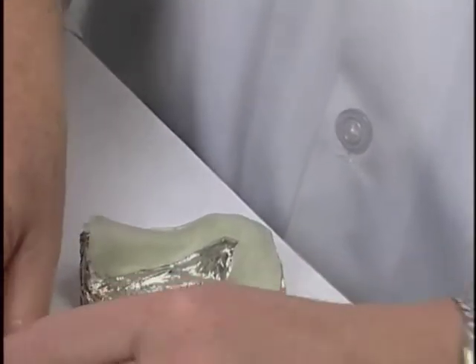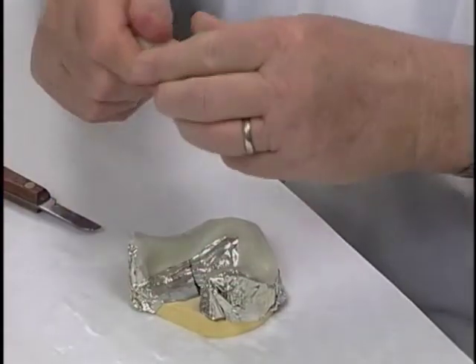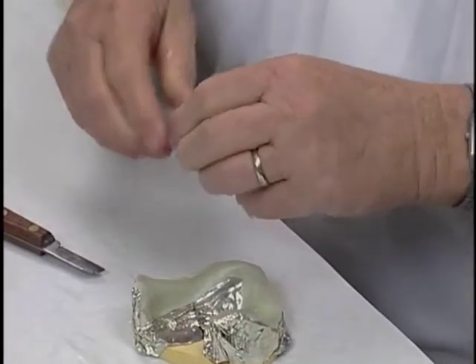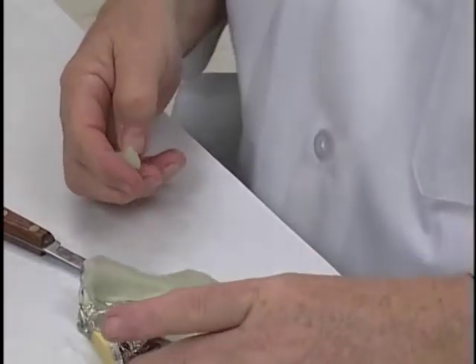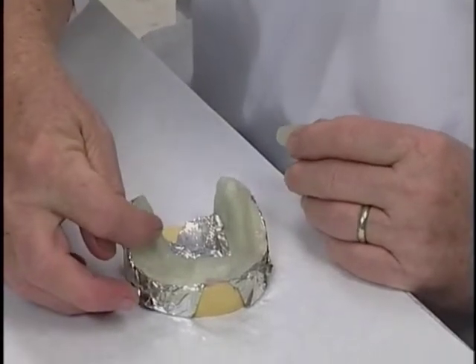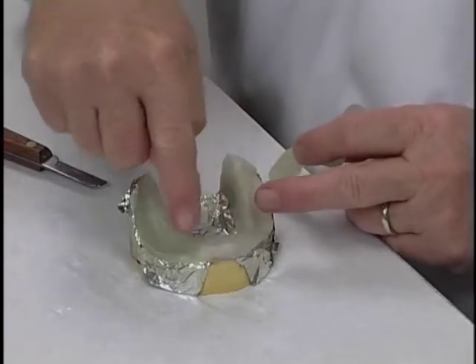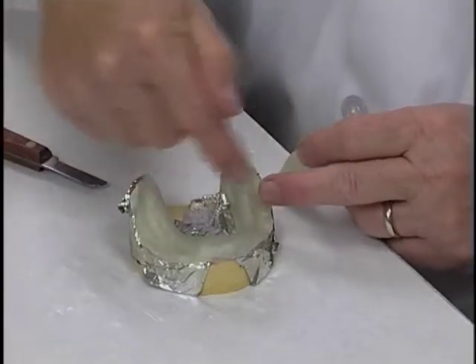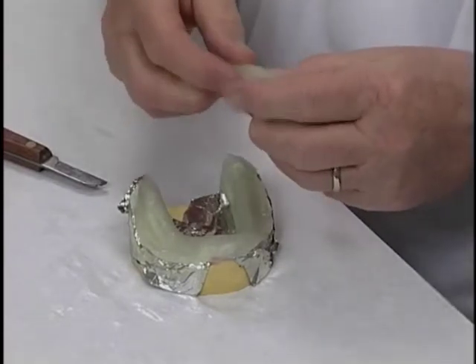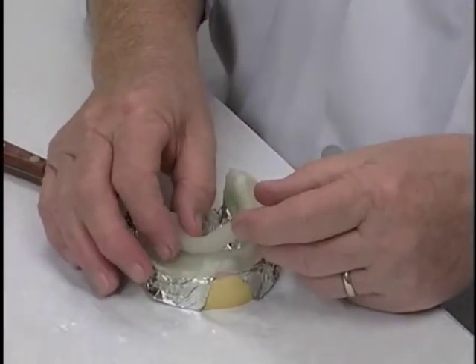And now I'm going to gather all of the excess material that is remaining, and we're going to mold that material into a long, narrow strip. For the mandibular arch, the handle is going to be quite different than what it is on the maxillary arch. The handle is actually going to extend from about 2/3 of the way back the ridge on either side posteriorly all around the labial area to about 2/3 of the way around to the other side. And we do that by just taking the excess material, mold it into a nice little rope of material about so long, and now we're just going to adapt that.